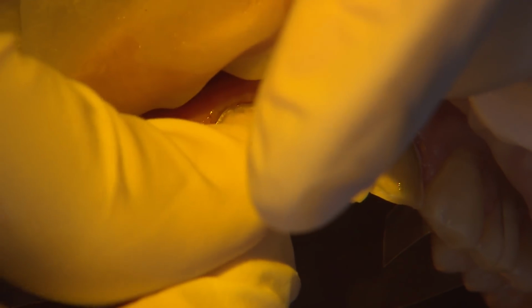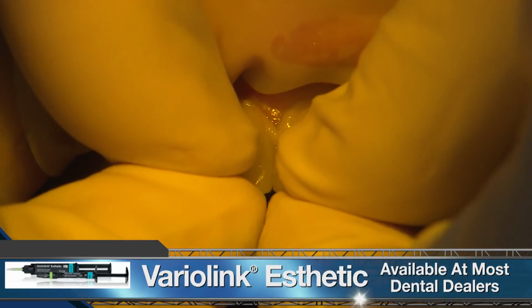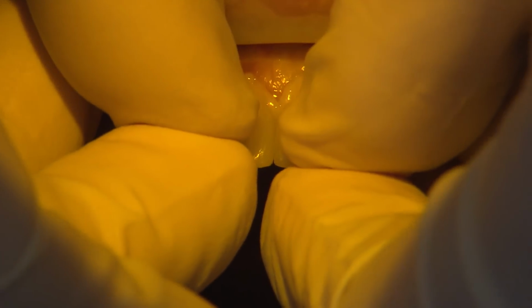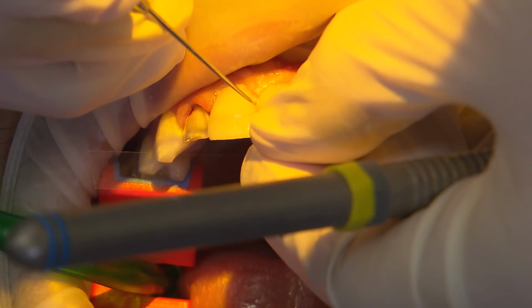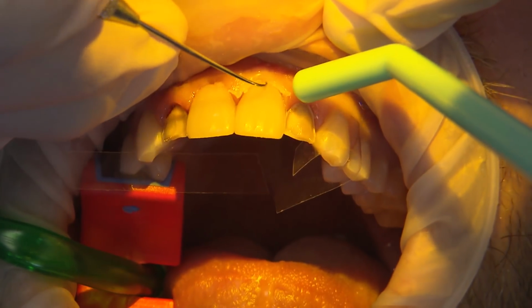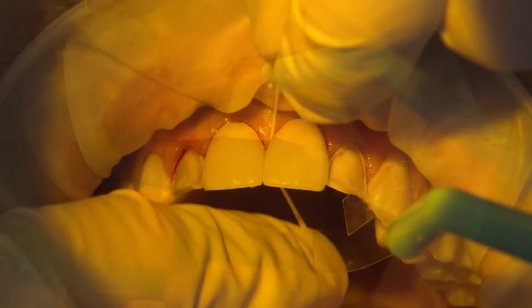Since the adhesive is a dual cure, after air thinning to remove the solvents, I go ahead and seat 8 and 9 using VariLink Esthetic resin cement. I really like using this cement for aesthetic situations because it is available in 5 different shades that can increase or decrease the value as needed. There are try-in pastes that correspond to each of the shades, so you can determine which shade will work best for each case. We went with the neutral for these veneers as we didn't need to alter the final shade with the cement.